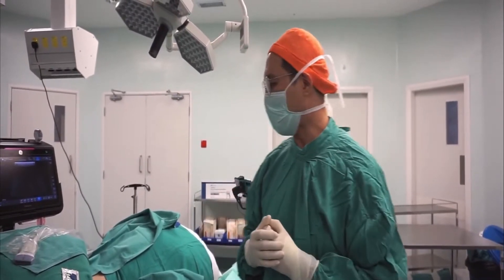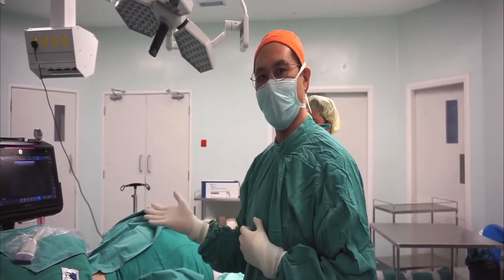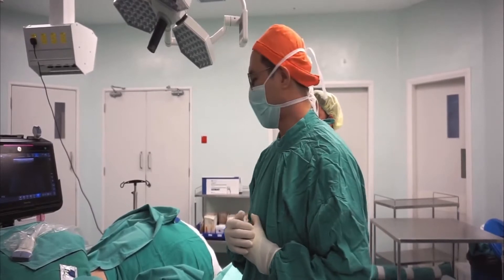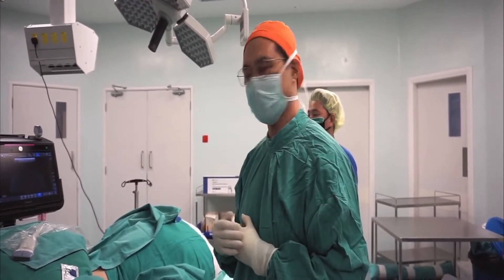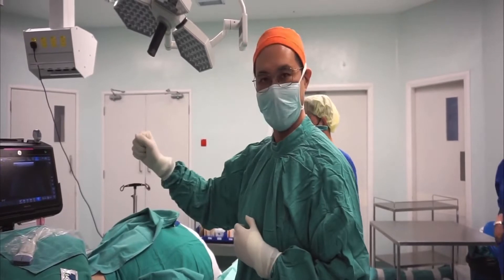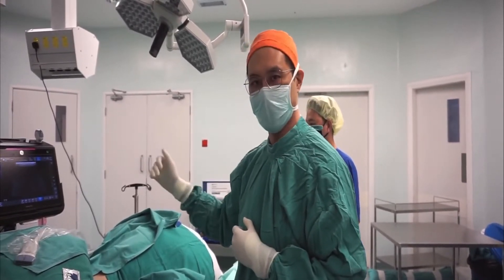Today we have a patient who has just undergone a laparoscopic nephrectomy. The surgeon has made a couple of incisions around the umbilical area on the right side and also has made a right suprainguinal incision.